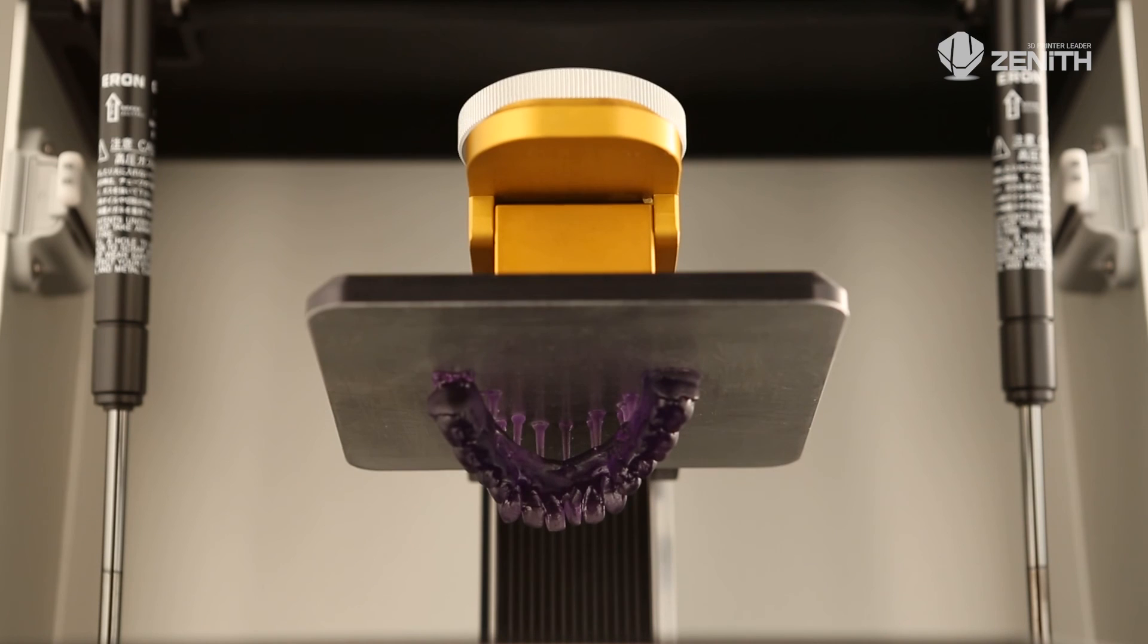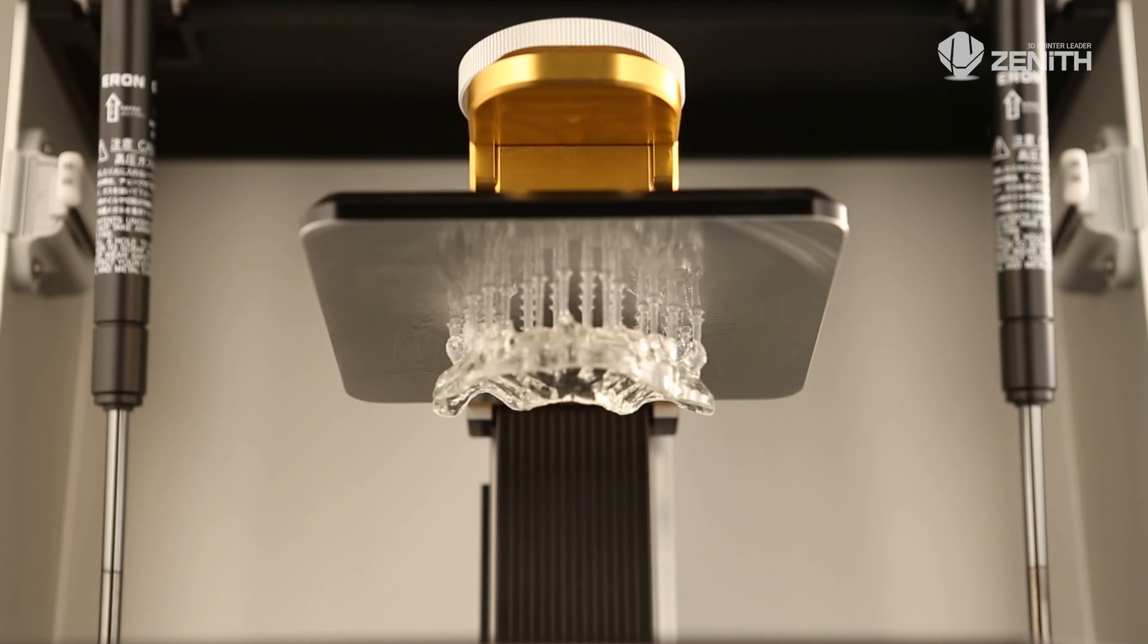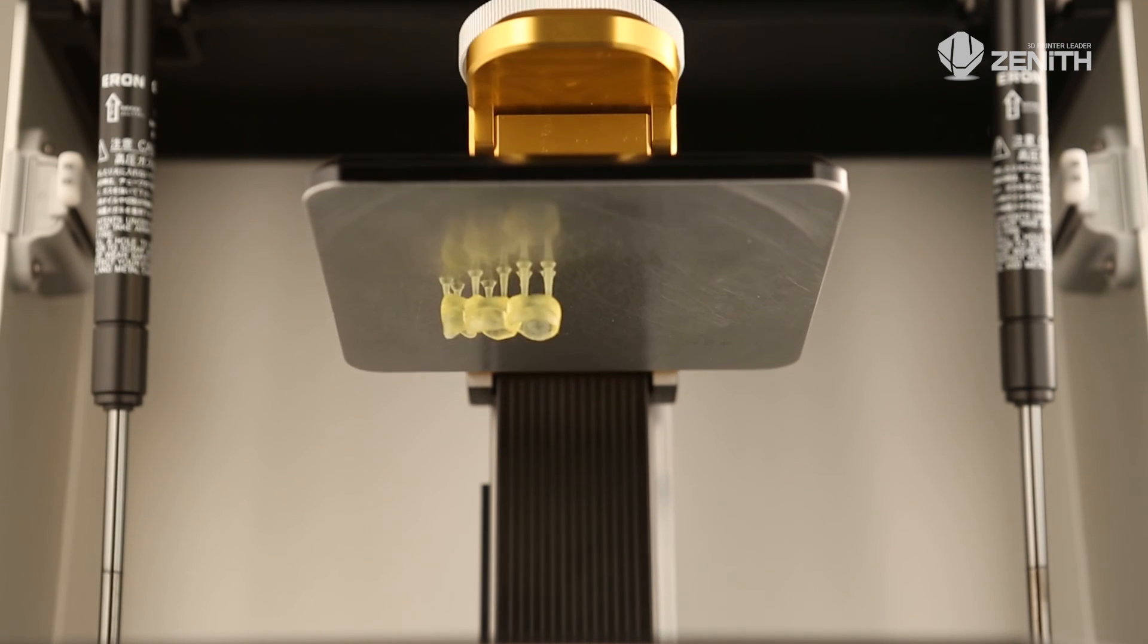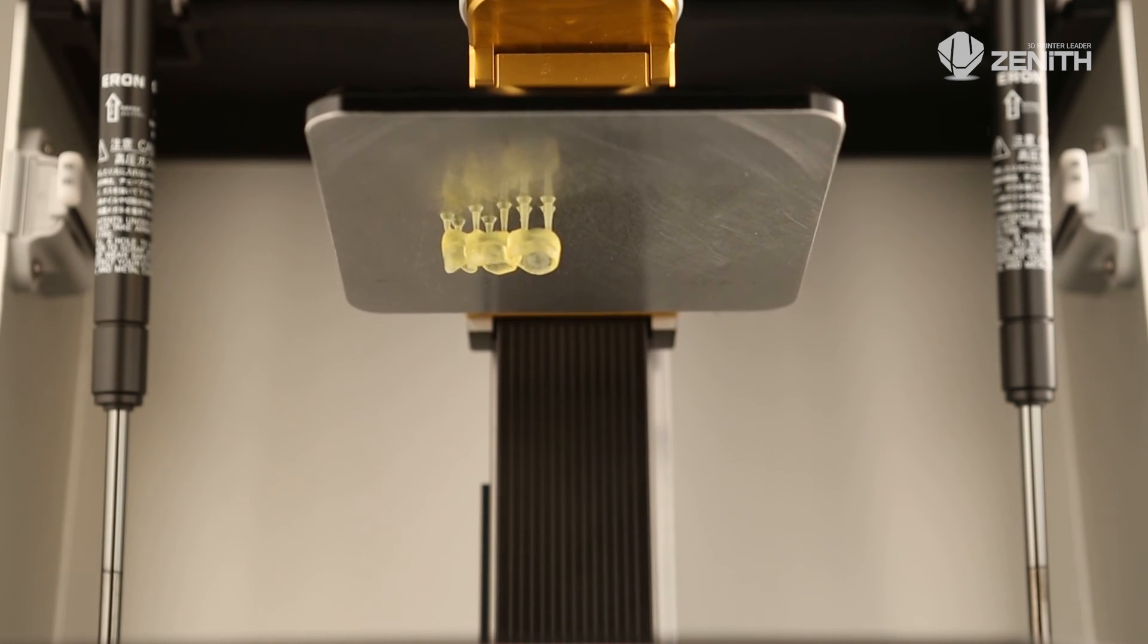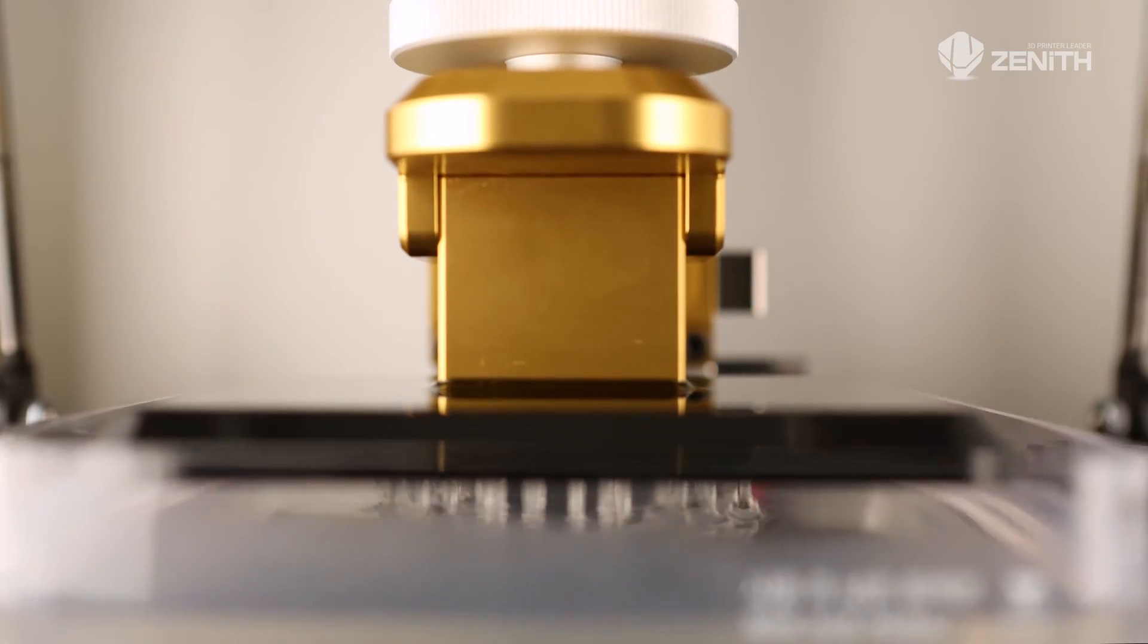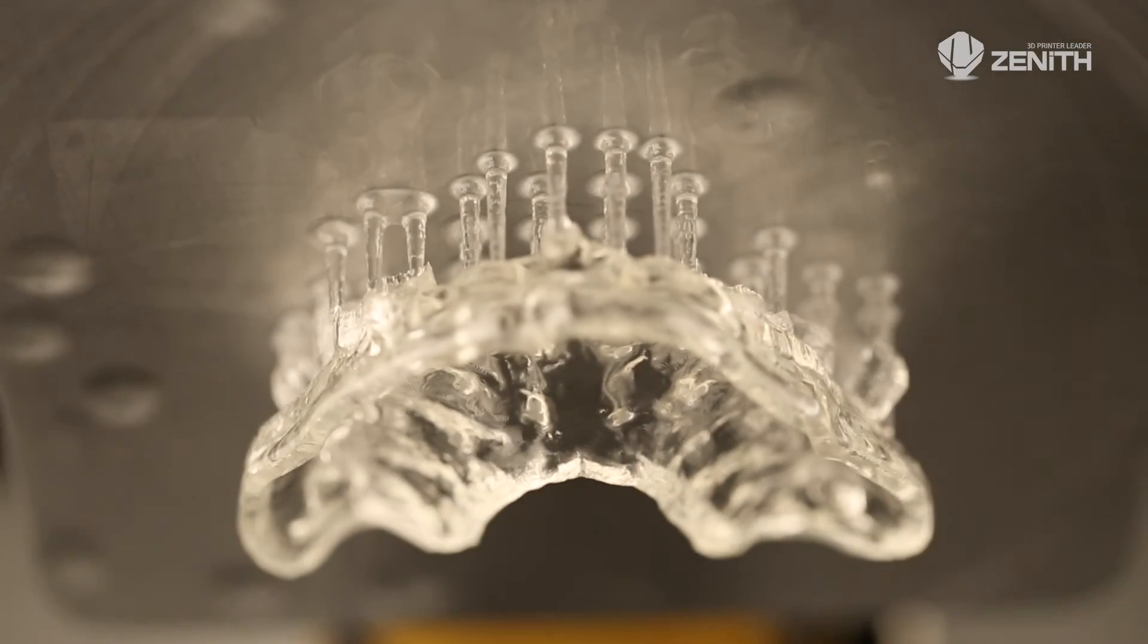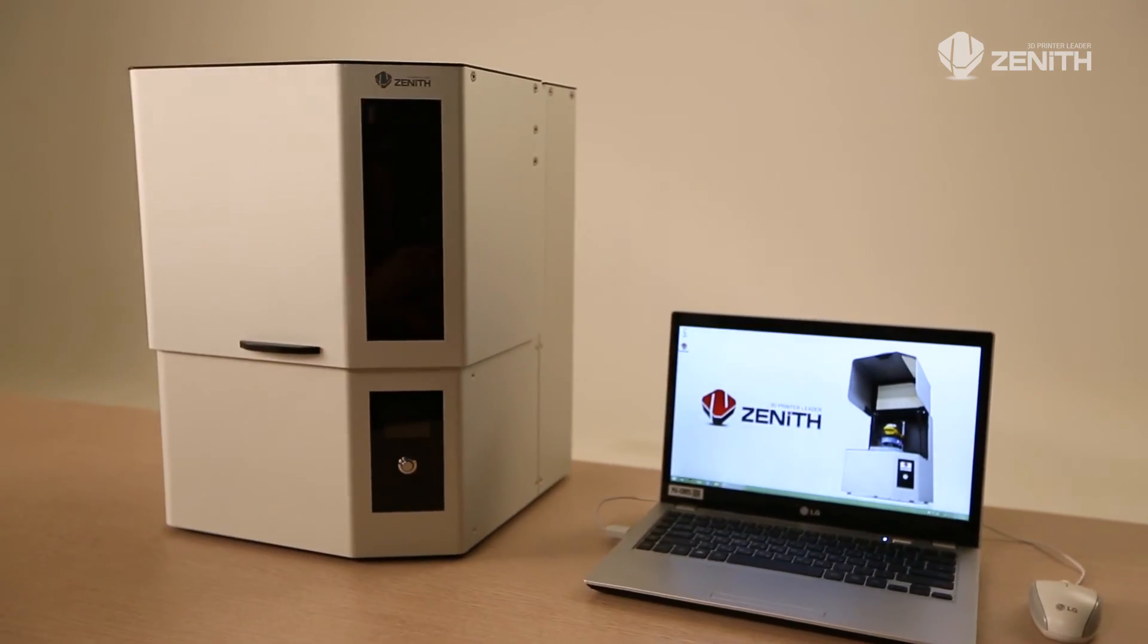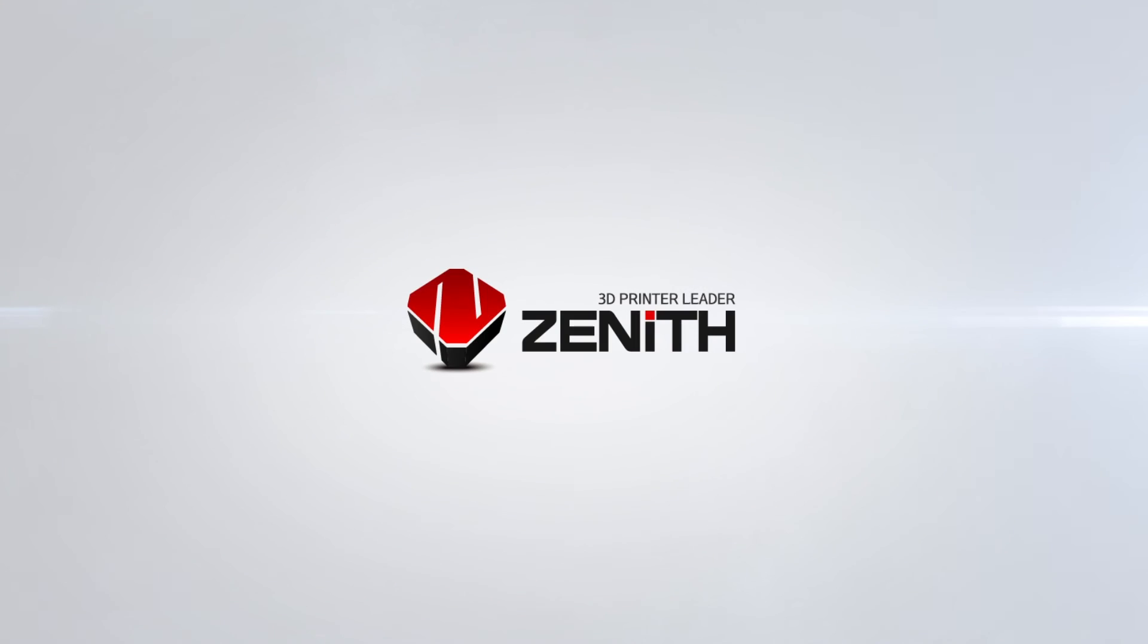Print out the optimal model for you, such as dental models, clear aligners, surgical guides, and wax-ups by yourself. The leader of the 3D printer industry: Zenith.